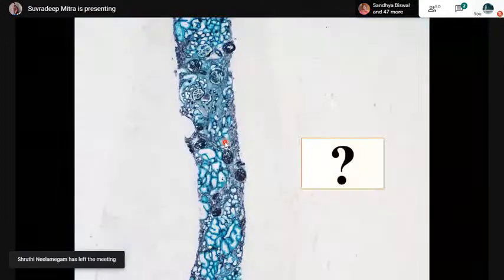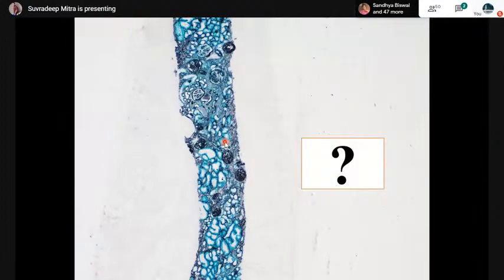This is one photograph just to show you practically how it looks. It's a silver stain. You count 3, 4, 5, 6, and like that. And these are all globally sclerosed glomeruli. So it's easy even in this low magnification to ascertain whether the pathology is involving more than 50% of glomeruli or not. And then you can comment whether the disease is diffuse or a focal disease.